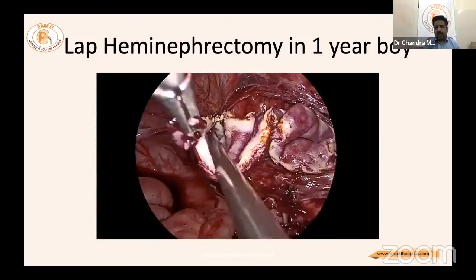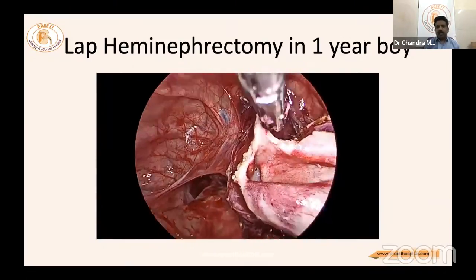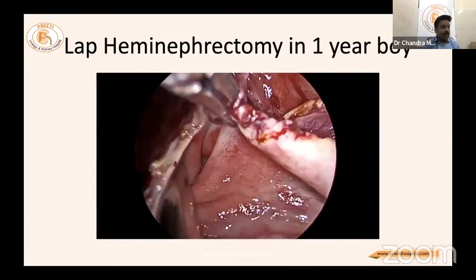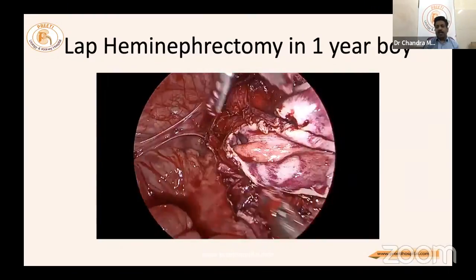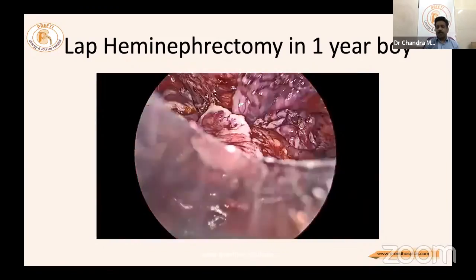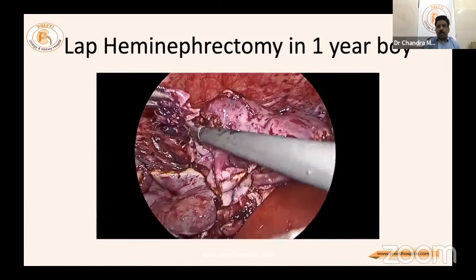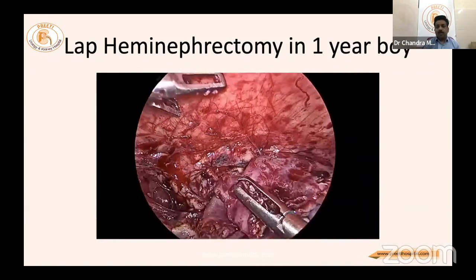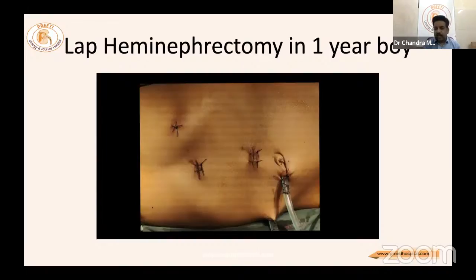The lower pole ureter must be checked each time to ensure pus is removed — this is a convoluted ureter. Suck out all pus, go as low as possible, and leave it; do not separate it. The dead upper pole system is placed in a bag and removed in pieces through the ports without any additional incision. A drain is placed. Identification of the lower pole ureter and careful dissection close to the kidney and ureter preserves both lower pole ureter and renal vessels.